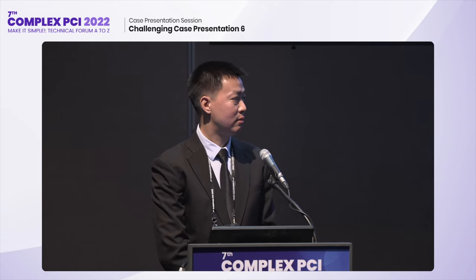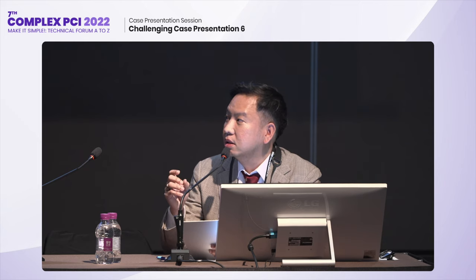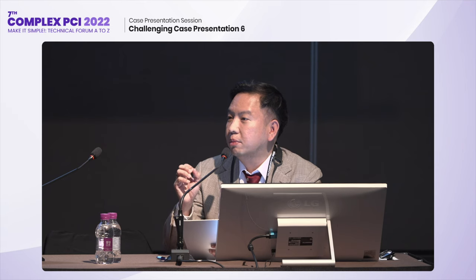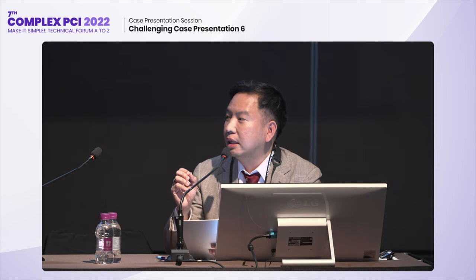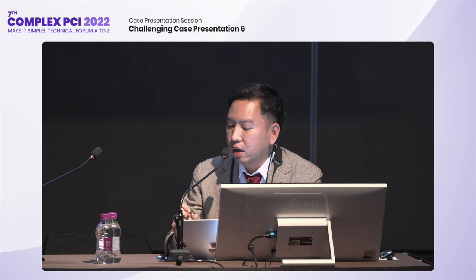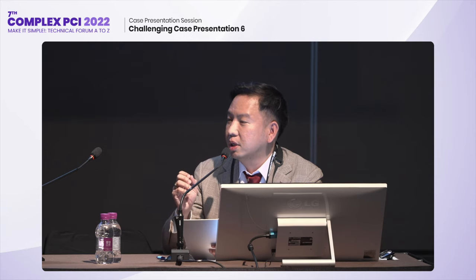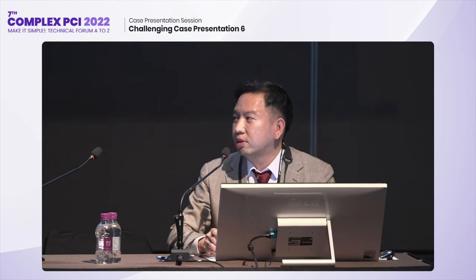Okay, and in this case, I see you started rotablation with a high speed. Yes, 200,000. Too high a speed in the beginning can induce platelet activation. If you start from a little bit lower, slower speed and then step up to faster, I think it may be better. Thank you. Thank you.